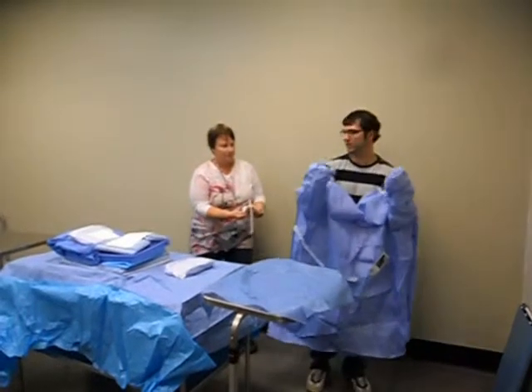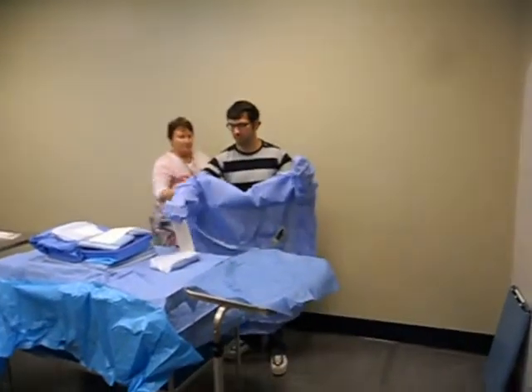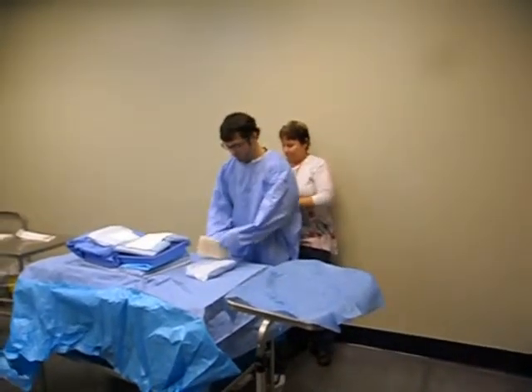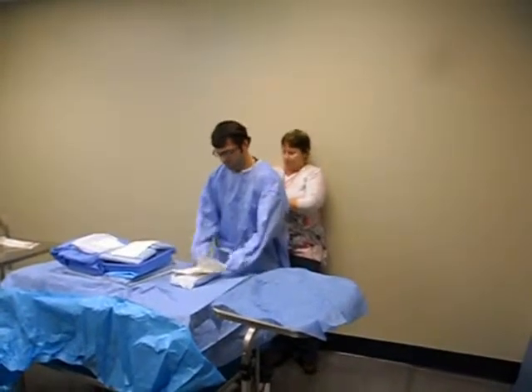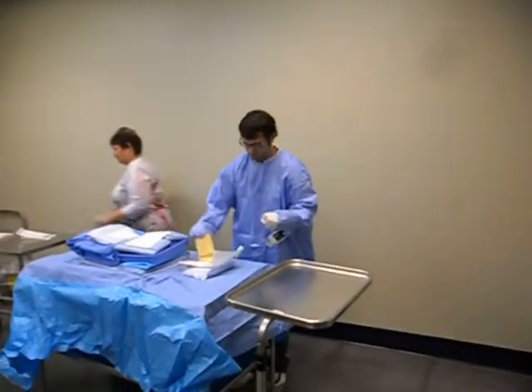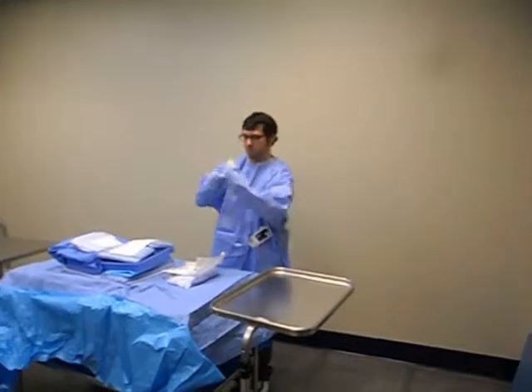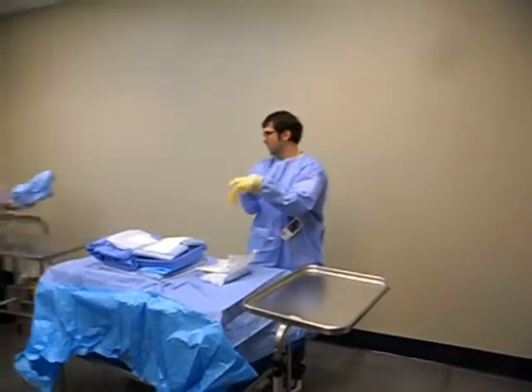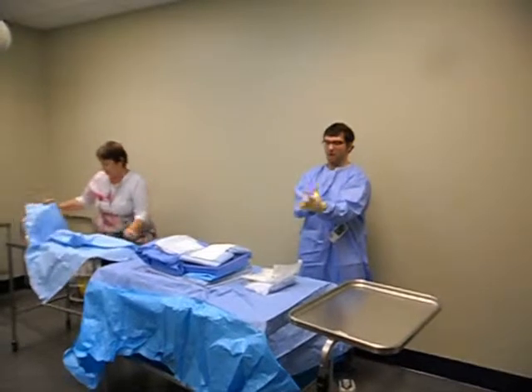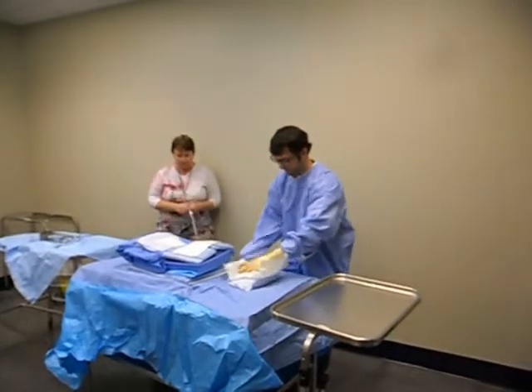This is a little big for me, but it'll work. Joel, I'm going to open up your Belfour on this table. Right now I'm thinking about how many people are going to be in here. Do I need any gowns? Obviously a surgeon's gown. This is a big case, probably a PA or another doctor, students, all that stuff.